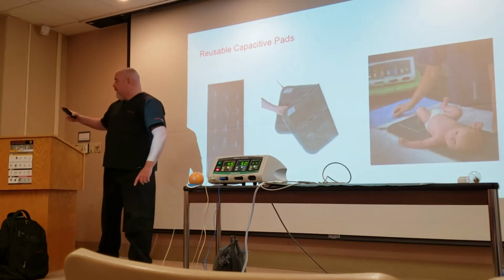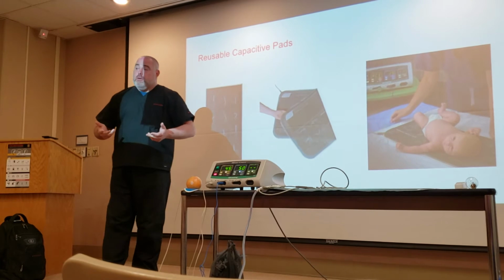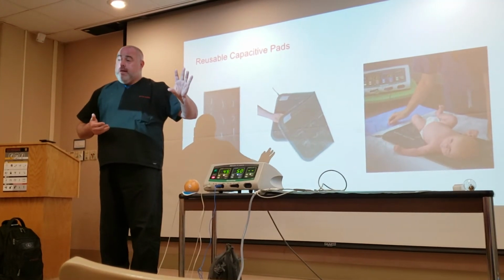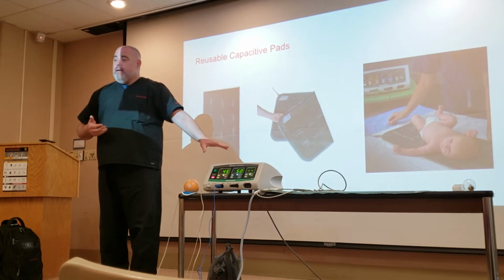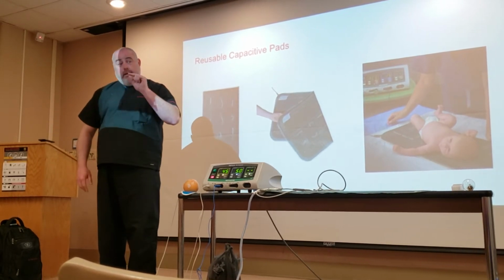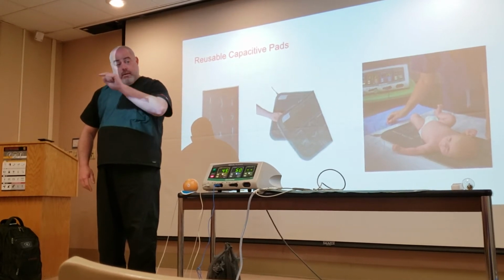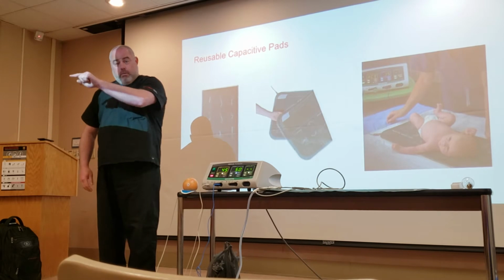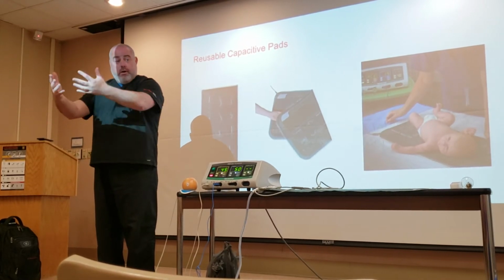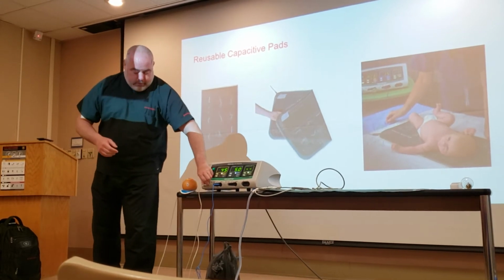Similarly, that's how our capacitive pads work. The big electrosurgical safety consideration with that is any electricity passing through the pad into the patient in that scenario. In other words, when I touch that screen, is electric charge actually passing from my finger? Do I get shocked at all when I touch that screen? The answer is no. It's an induced pathway, and these induce electricity as well.